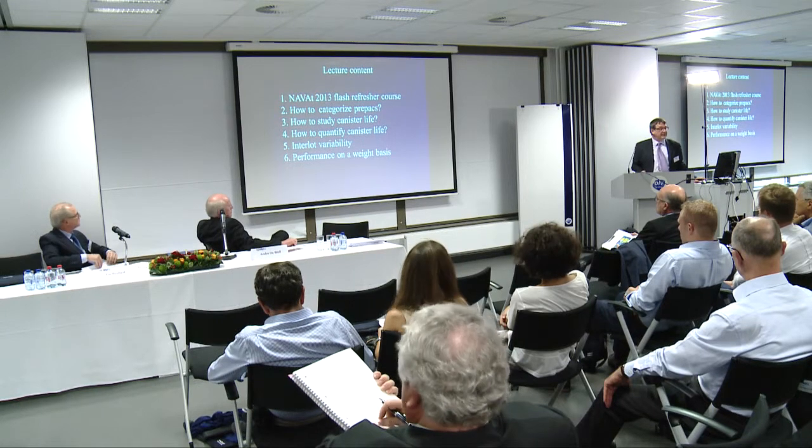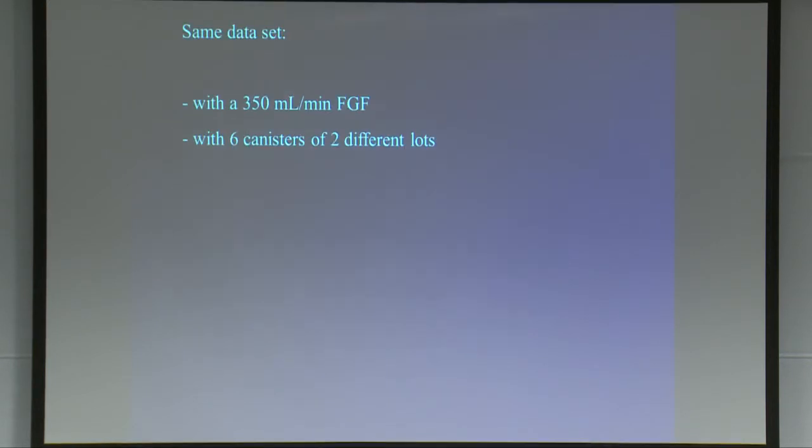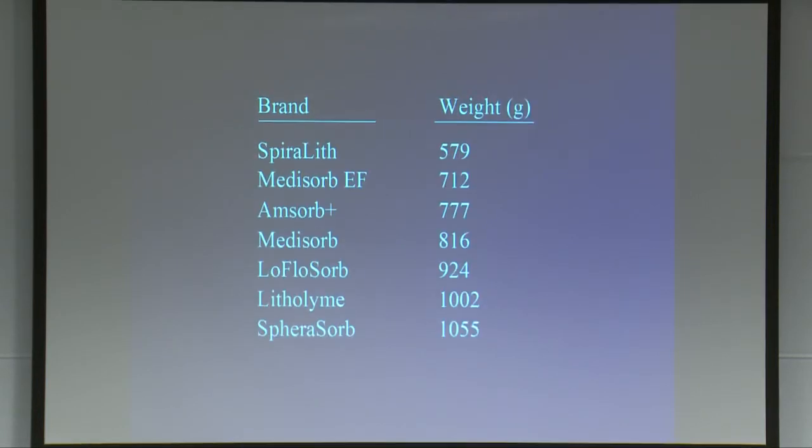Okay, I tested canisters, but now let's have a look at canister performance on a weight basis. I'm going to use the same data set, but look at the weight contained in the different canisters. This is the brand, this is the weight of active ingredient. Again, this is a lithium hydroxide based product. These are all calcium hydroxide based canisters.